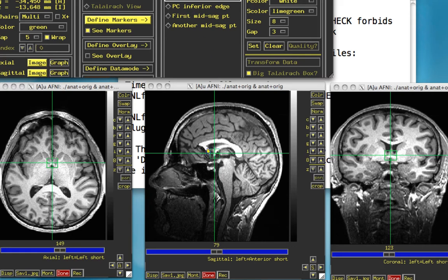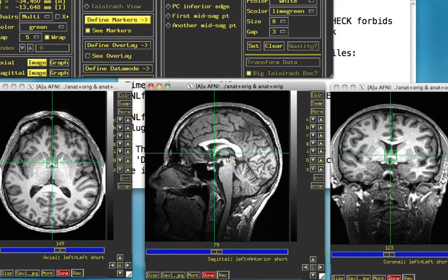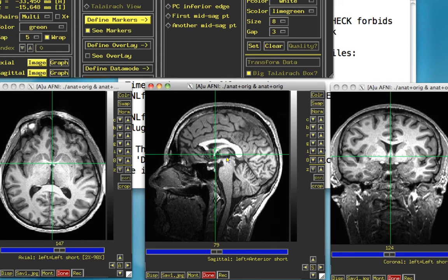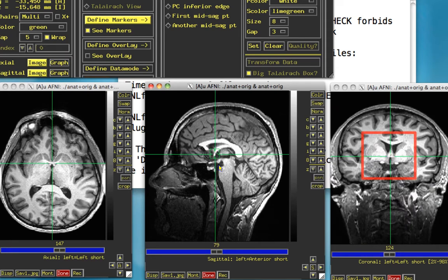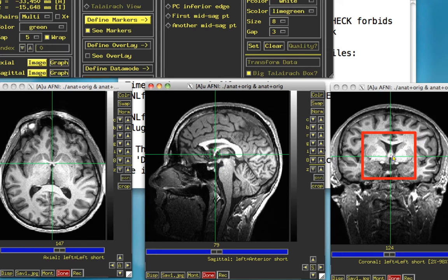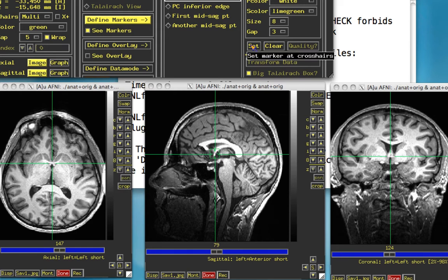For the AC Posterior Margin, as you might have guessed, it's at the very posterior edge of the anterior commissure, right in the middle. Use the arrow keys to go right a couple pixels, down maybe one or two pixels. Now look in the coronal section for when the anterior commissure disappears from view. Moving to the sagittal plane, go right one and the anterior commissure is gone. Go back, and right about here is where the anterior commissure starts to come into view. Click Set for the AC Posterior Margin.